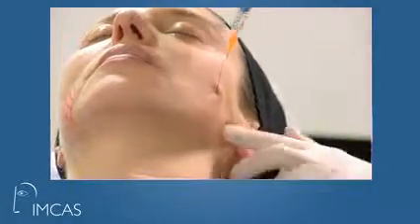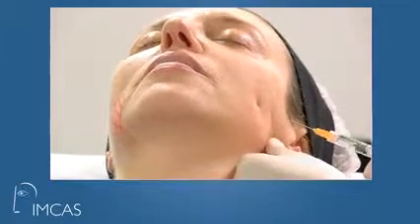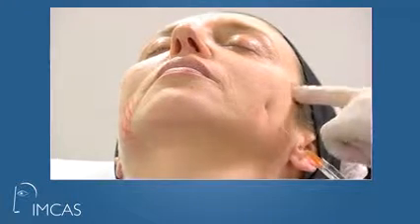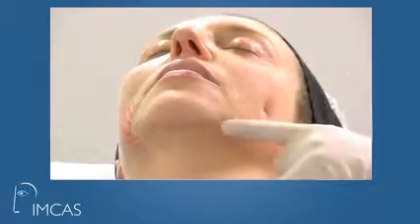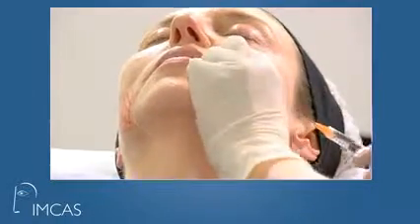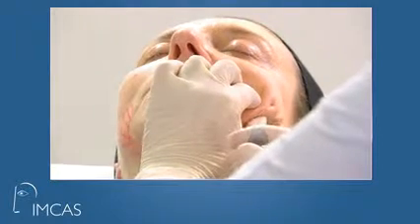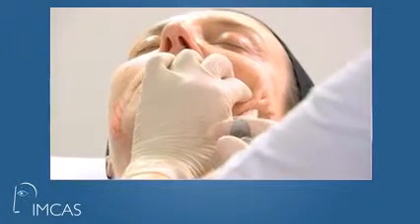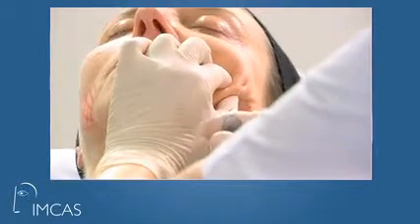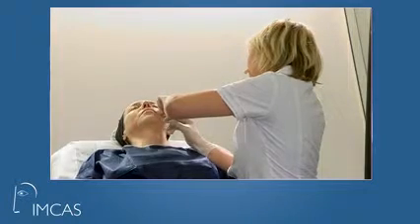Now, as Lagdar told us just before my presentation, this is very interactive between the zygomatic area and the contour line. So if we inject the lower part of the face, we have to consider injecting the upper part at the same time. So, for example, I am injecting the lateral contour.